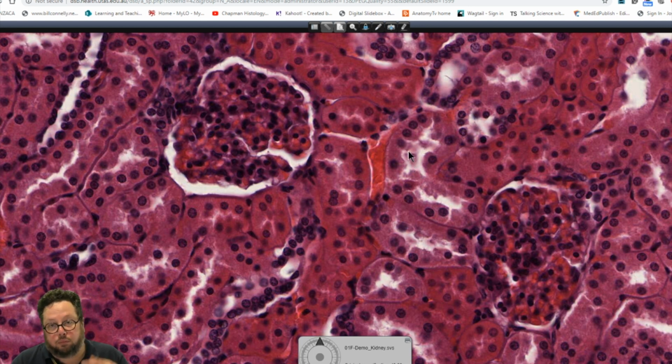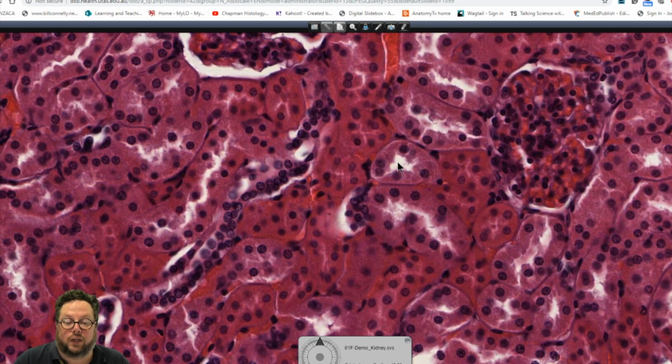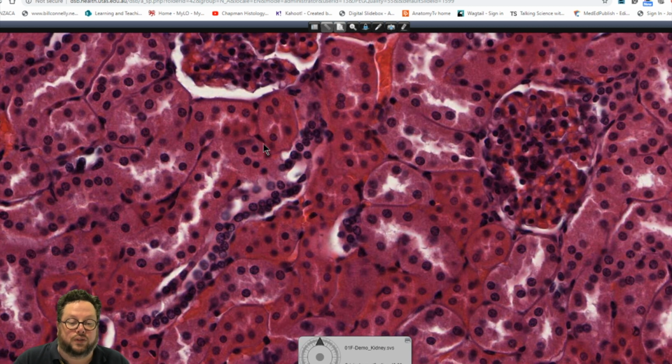We don't have a brush border on the surface of the distal convoluted tubules. They do reabsorb primarily sodium, and water follows down that as well, but they do have the basolateral membranous infolding, so they do have basal mitochondria to help move substances against that concentration gradient. So what you're looking for is slightly paler pink staining and a more clear lumen, and these are the distal convoluted tubules. So you can see here quite a nice lumen in comparison to here, for example. You can barely see the lumen here because of all the microvilli present.